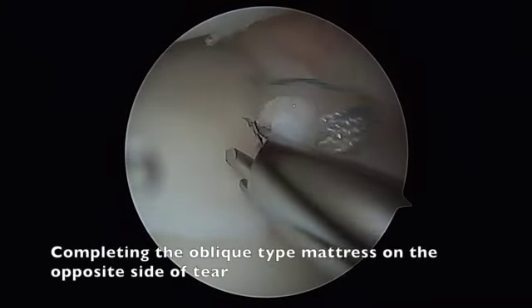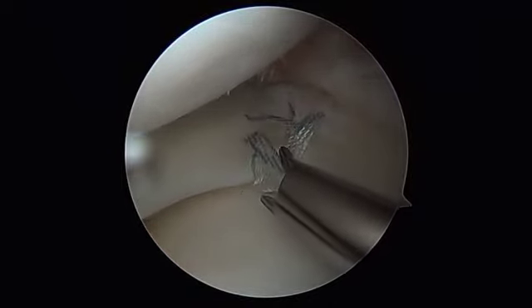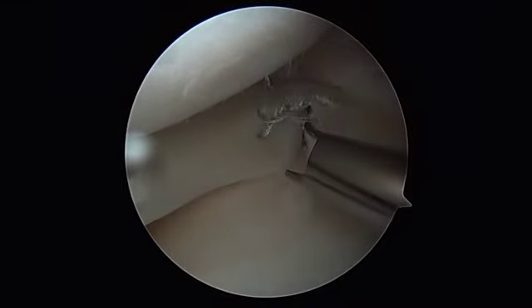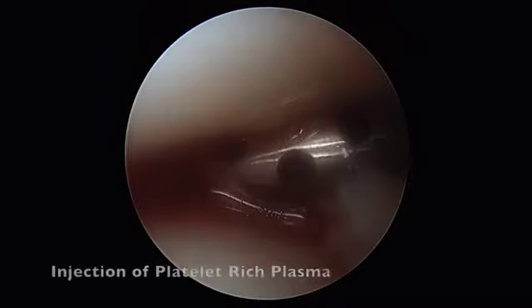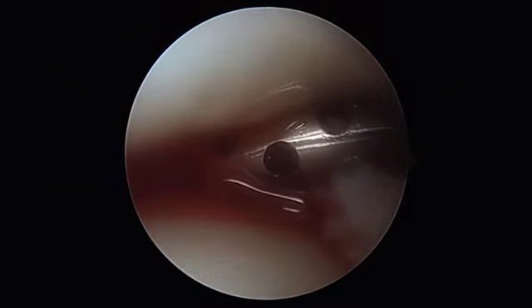After all sutures are passed, they will be located along the lateral knee, where a soft tissue dissection is carried down through skin and subcutaneous tissue along the trajectory of the sutures to the capsule where they are tied. It is important to note that all slack must be taken out of each suture prior to tying, and the maintenance of reduction should be checked arthroscopically prior to tying each suture sequentially. This is the final repair, which consists of two horizontal mattresses and an oblique-type mattress. The case is then completed with the injection of platelet-rich plasma.